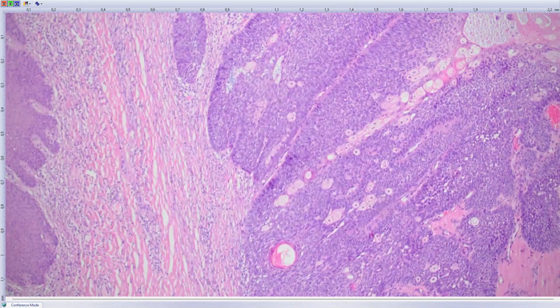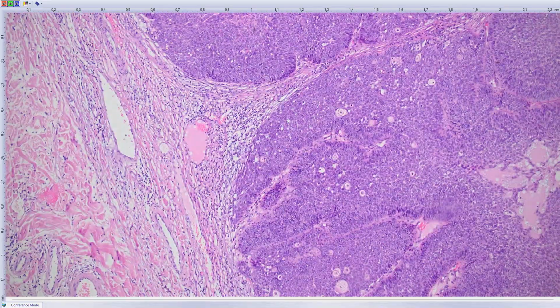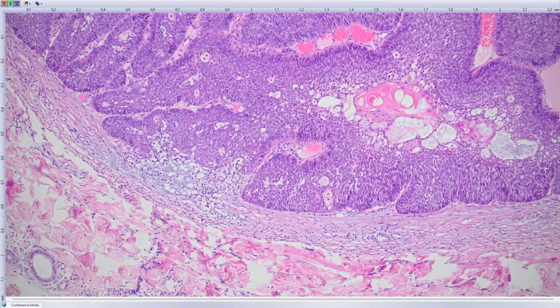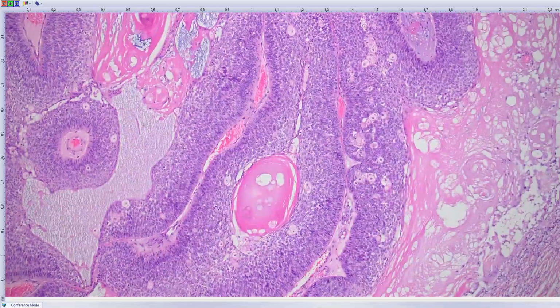It's completely excised. I cannot really see cytological atypias here, and the growth pattern is expansile, or maybe it's low-grade carcinoma. But it's not important because they behave very similarly. Agree. Whether it's low-grade carcinoma or adenoma, when it is extraocular. Yeah. And this is very important information.